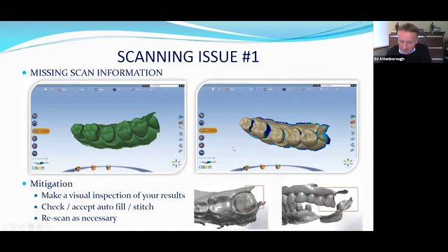So when you're trying the software out, it's not only how ergonomic and easy the hardware is to use, but it's also some of the workflows within the software that are important and really useful to get to the bottom of when you're making a decision.